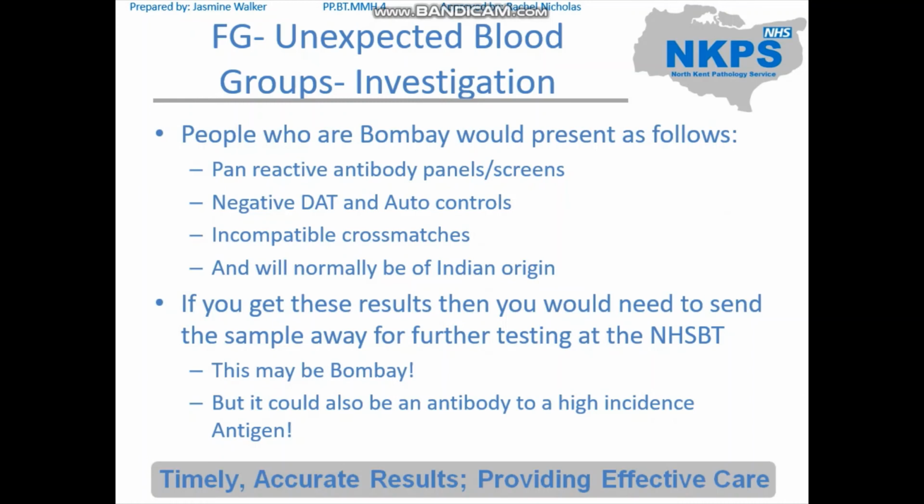But be wary, it might not be a Bombay. This patient could also present with an antibody to a high incidence antigen, giving all of the same reactions. If you do have a patient that you suspect is Bombay or has an antibody to a high incidence antigen and you need blood for the patient, you would need to discuss this with the NHSBT. Quite often with the antibodies that are clinically significant in these scenarios, the NHSBT has blood frozen on site. So in an emergency, there would be blood that we could get that would be suitable for the patient.